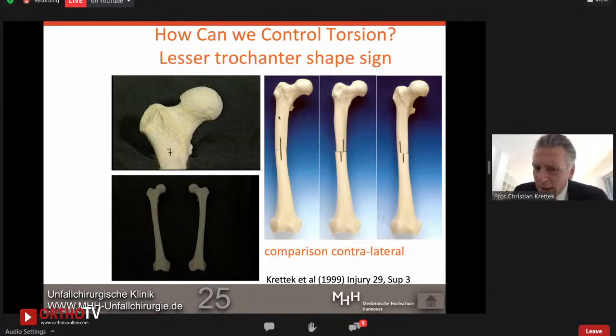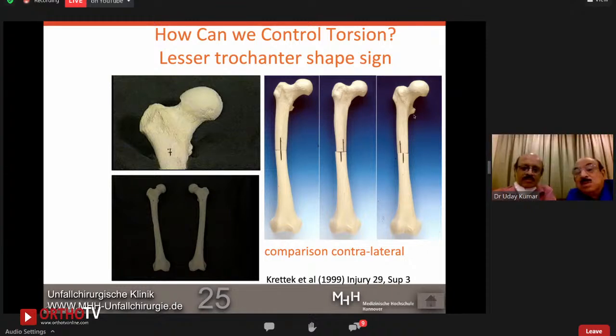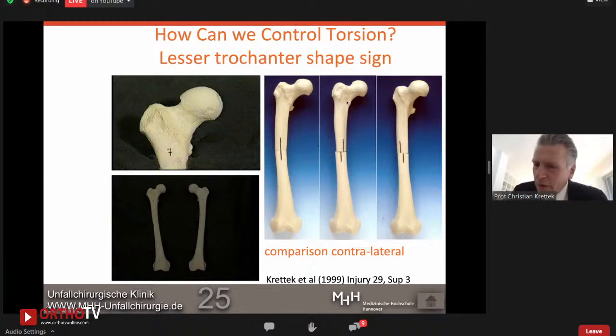demonstrates it. Here is a femur, and it is cut in the mid shaft. And look, only very few millimeters of rotation cause a significant change of the lesser troch shape. Can you see? Only very few change creates a change.